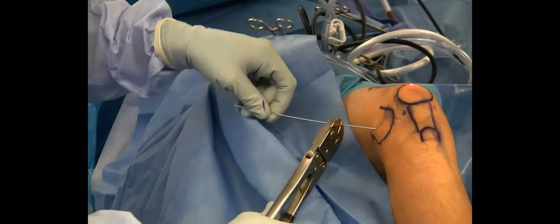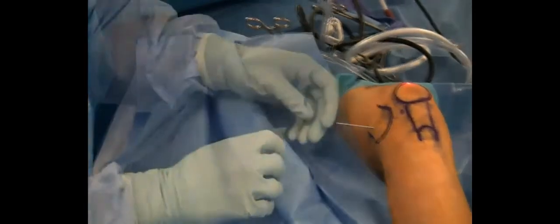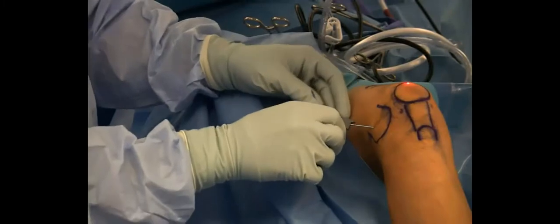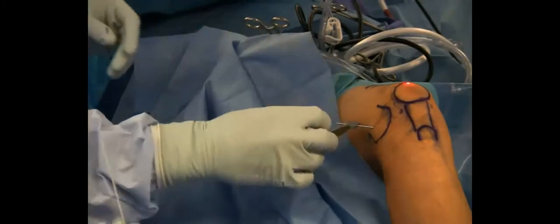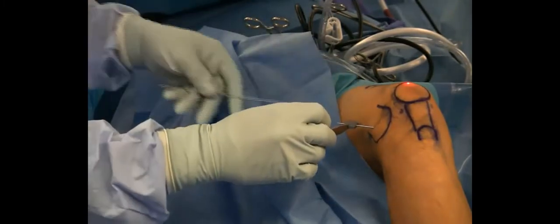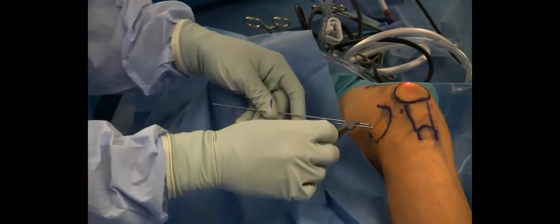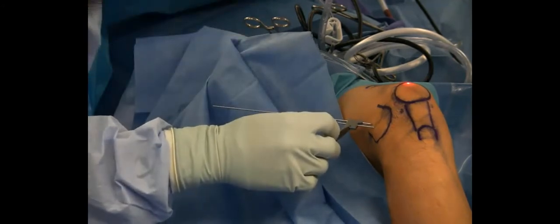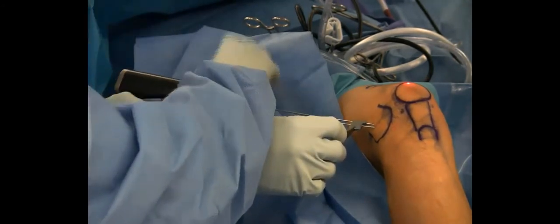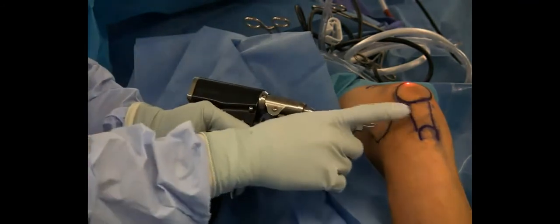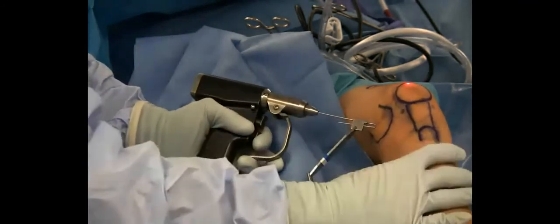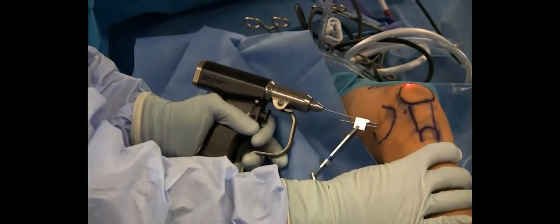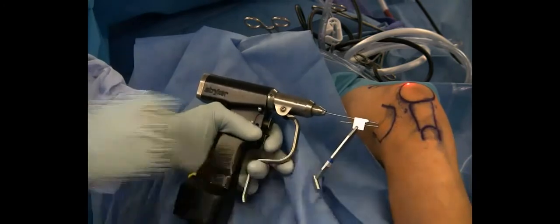When we like the location of our first pin, we cut it, and we can use this as a guide for the subsequent drillings. There are two ways to perform the subsequent drillings. Depicted here is an offset guide technique. There's a 5mm offset guide which enables you to drill parallel to the first pin towards the lesion.